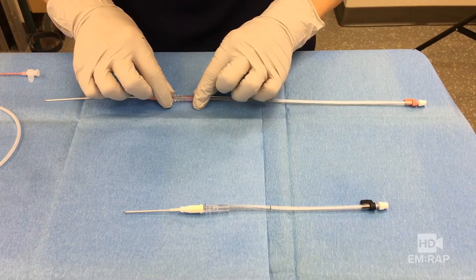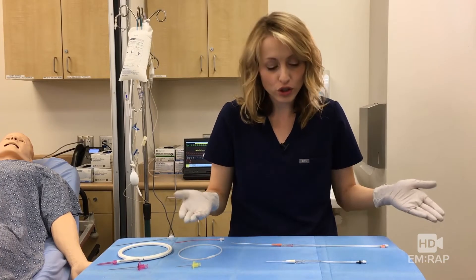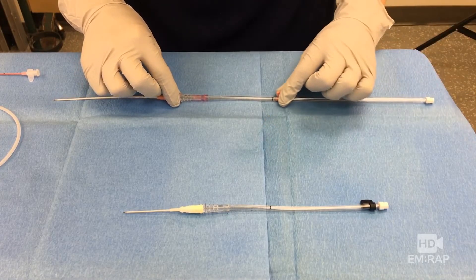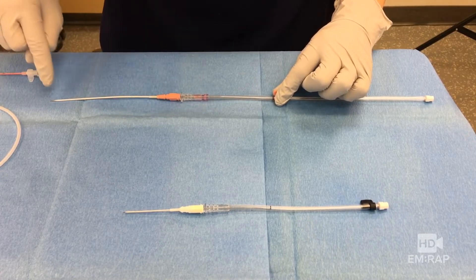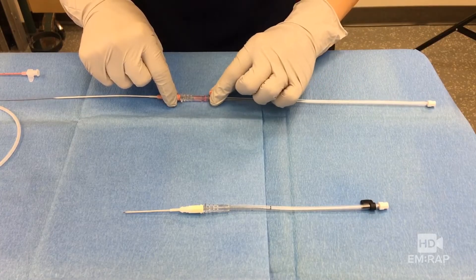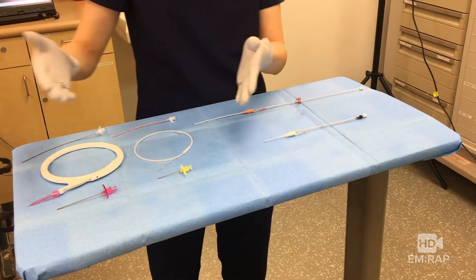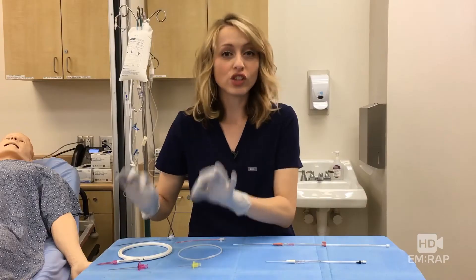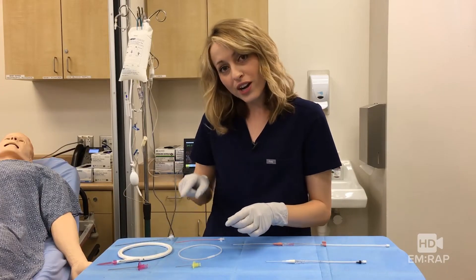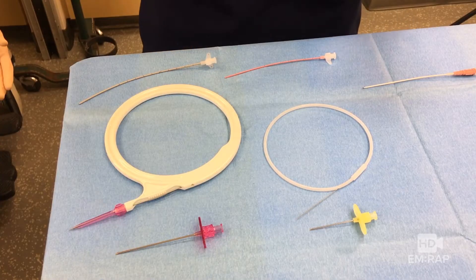The guide wire piece connects to the angiocath like this, and now it's a single unit — just like this one, just a bigger version. Once you cannulate the vessel, you slide this down to the marker, and that's when you know that the wire is at the needle tip. Then advance the wire as long as it's going smoothly, and the catheter feeds over the wire. Alternatively, if you have the kit with component parts, this is just like a central line: you have a needle, you cannulate the vessel, you feed the guide wire through the needle, you remove the needle, and then you advance the catheter over the guide wire.